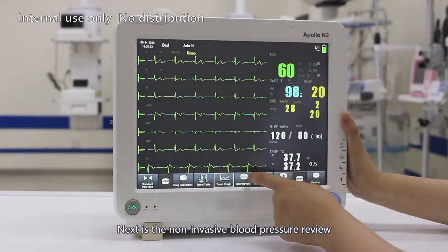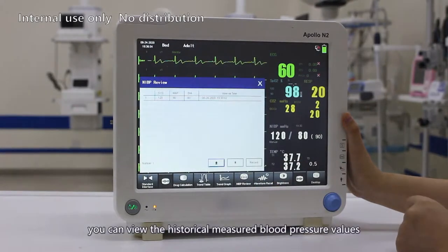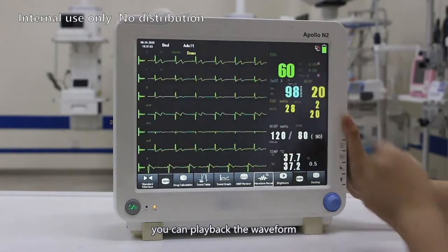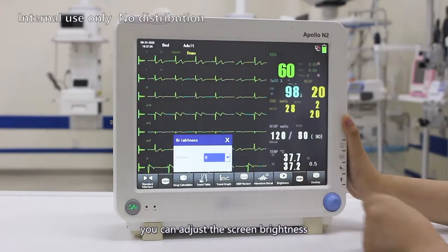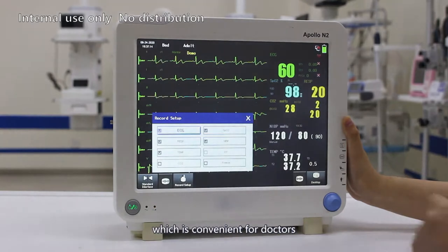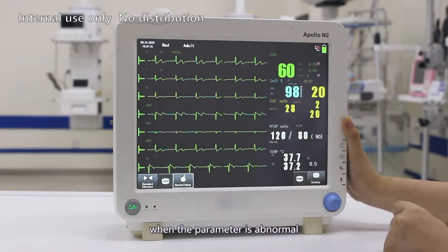Next is the non-invasive blood pressure review. You can view the historical measured blood pressure values. Next is the waveform playback. You can play back the waveform. Next is the screen brightness. You can adjust the screen brightness. Next step is the record output settings, which is convenient for doctors and nurses to capture the moment when the parameter is abnormal.